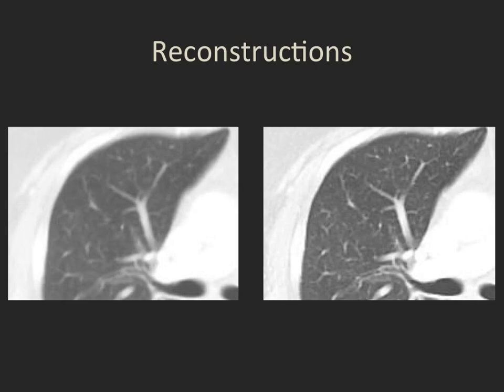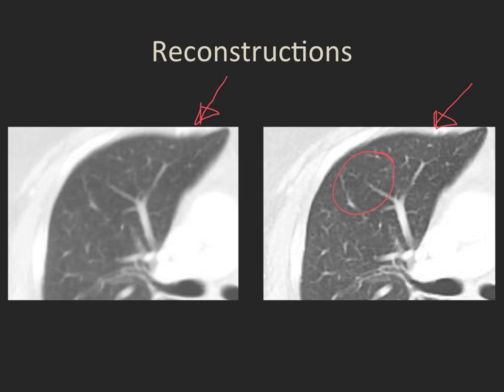On the left, it has been reconstructed with a conventional soft tissue algorithm. You can see that while you can see the lung parenchyma fairly well, it's a little blurry. Both of these are being displayed in the lung windows. On the right, the data has been reconstructed using a typical lung algorithm — a very crisp and contrasty algorithm — giving very nice resolution of these small vessels within the lung parenchyma.